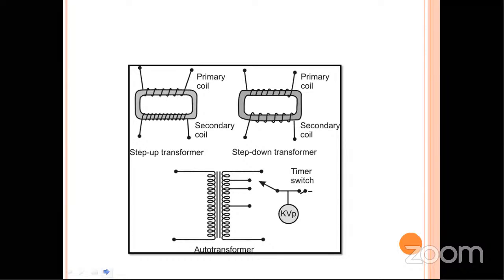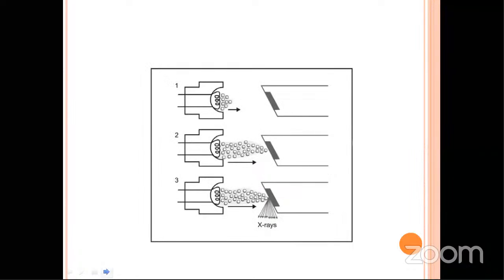So 3 different types of circuits are also there in the intraoral IOPA machine. So here the filament is heated up to incandescence and the electron cloud is produced, and after the exposure these electrons pass from the cathode to the anode and produce X-rays.